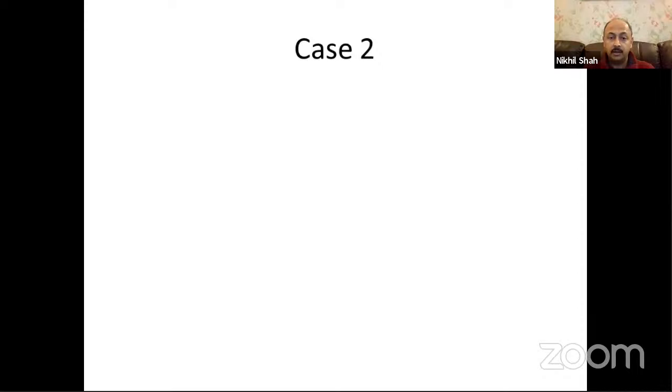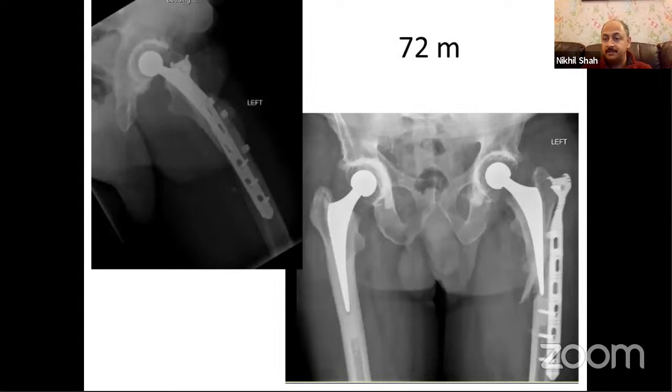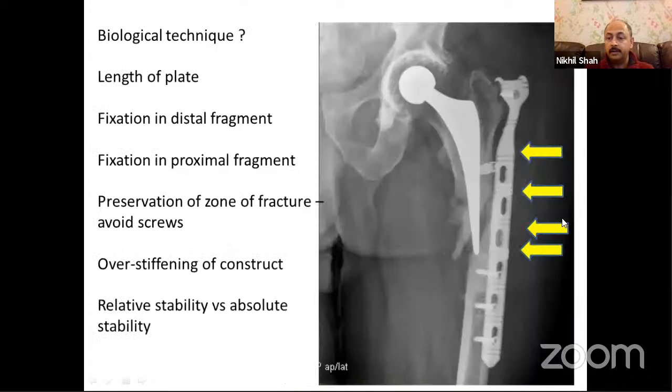So let's look at another case where perhaps the fixation is not quite what we wanted based on the philosophy that we just saw. So I inherited this patient. He came from abroad. He had had a cemented hip replacement done in the UK, fell on holiday, had a fracture, and it was fixed with this type of plate. Now we can see, if we go back to the principles, we can see that it hasn't really followed the principles that we outlined.